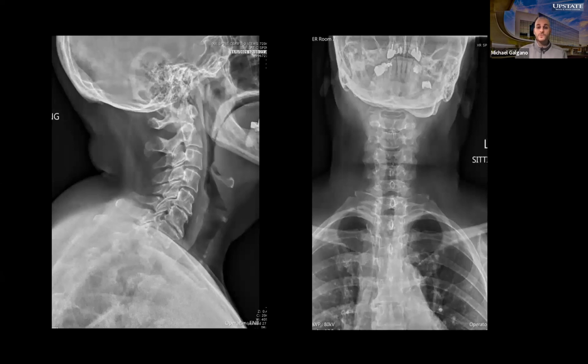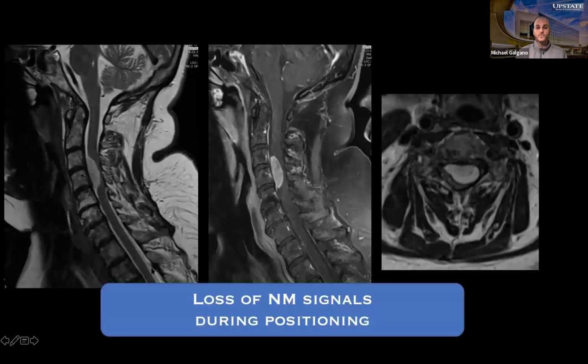So when I was in neurosurgical school, we never got upright x-rays on a patient with an intradural tumor before. But I think it's really important to do that because these patients, as they age, develop this high increased T1 slope here. So she's got beautiful cervical lordosis, but that's really only to be commensurate with the high T1 slope that she has here.